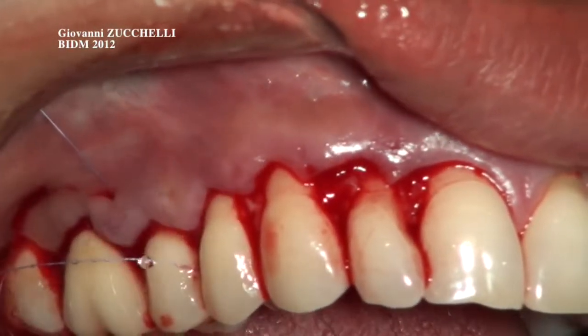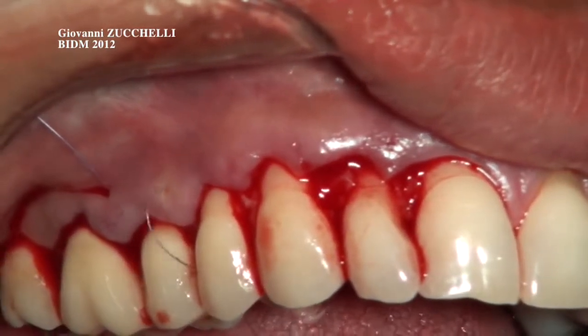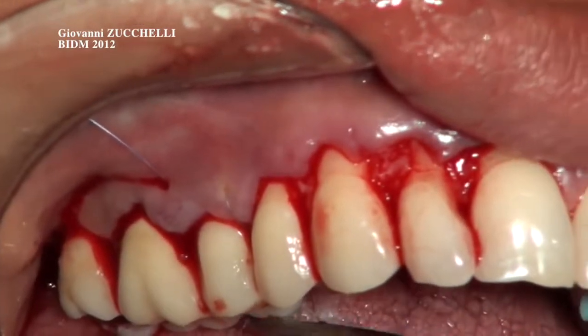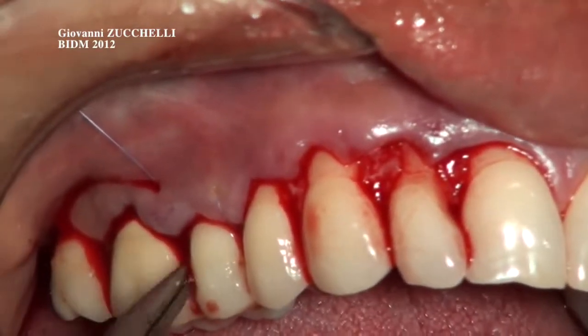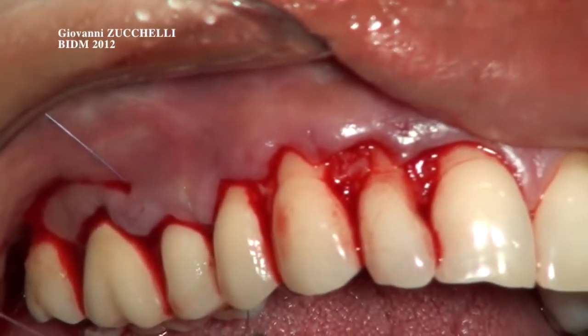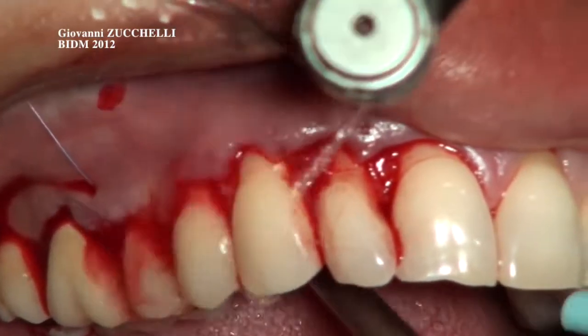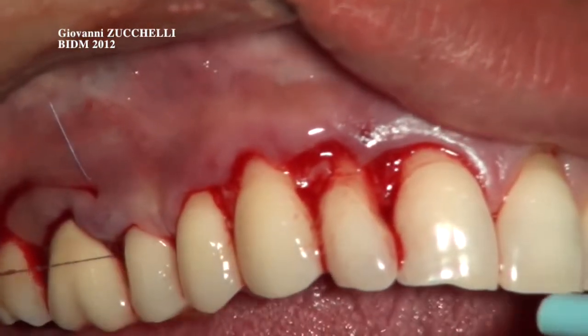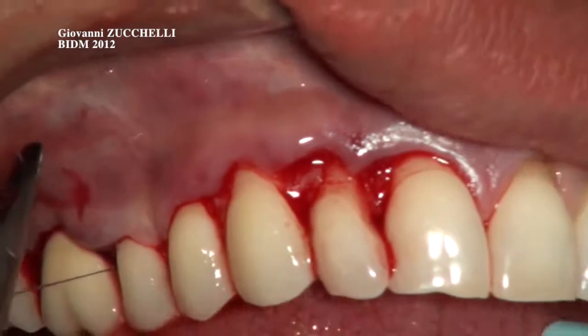Take the needle again from the palatal aspect around the palatal cingulum of the second premolar. There's no contact point here. And before closing this knot, this is called sling suture, you have to pull it.